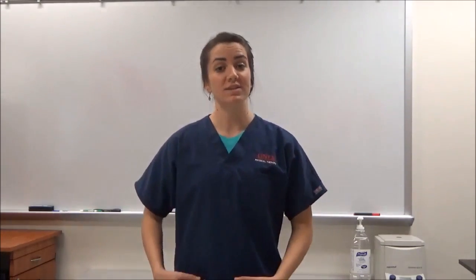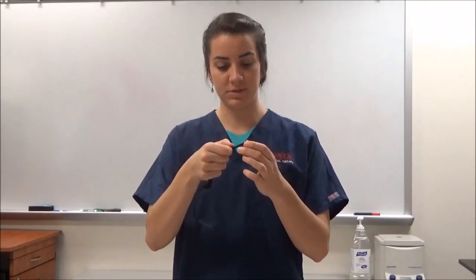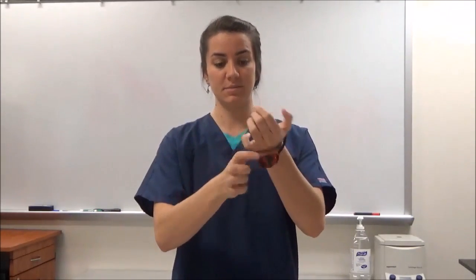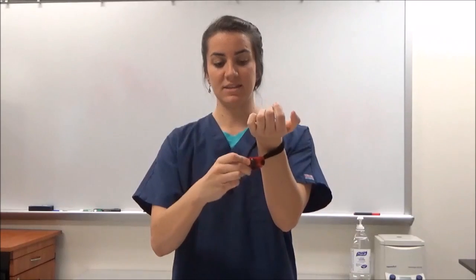When you are ready to give the monitor to a patient, you are going to want to set it up with one of the straps. There is a waist strap and a wrist strap option. For the wrist strap, thread the small end of the strap into one of the wings on the monitor. Bring the strap all the way through, then thread the small end again into the other wing, just slightly, enough so that the patient can then slip it on their wrist and tighten the strap.